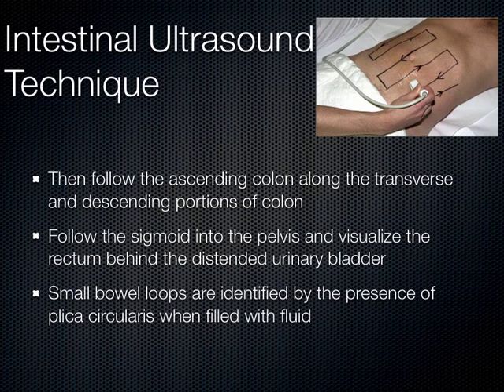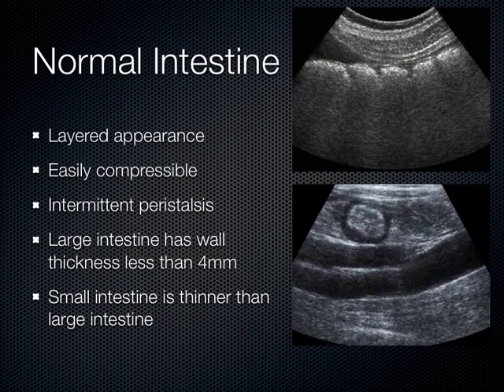And then, again, to try to differentiate small bowel from large bowel, difficult to do with air-filled loops of bowel in normal individuals, but when the patients have disease states, then you can really make out the plicae circularis. I'll show you some examples of that.